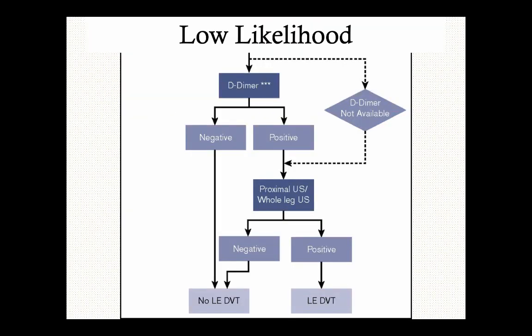And for those of us that may not be as comfortable, if you do get that positive ultrasound in formal radiology, just like when somebody sees something on a CAT scan that you don't see, you go back and try to find it. To me, I think there's probably a lot of opportunity for the residents and ourselves to go, oh, there's a DVT there. Let's go find it and take that time to learn what a positive looks like, if either you missed it the first time around, or you just need to. That's how I taught myself most of ultrasound, was going back and chasing ambulances to positive studies on CAT scanning or whatever.